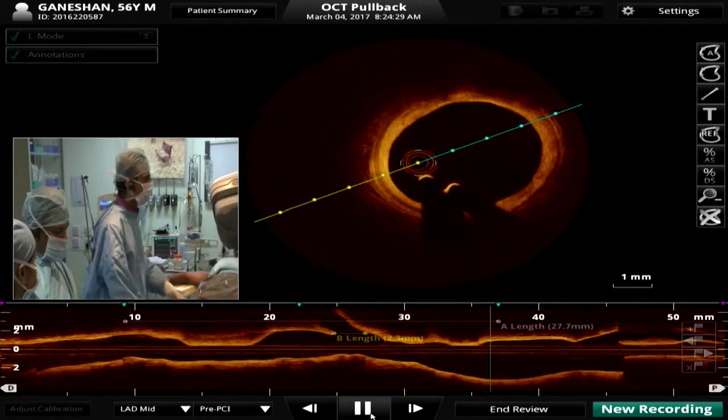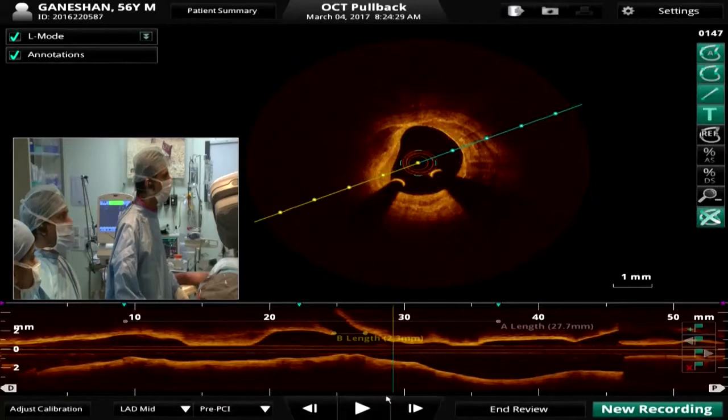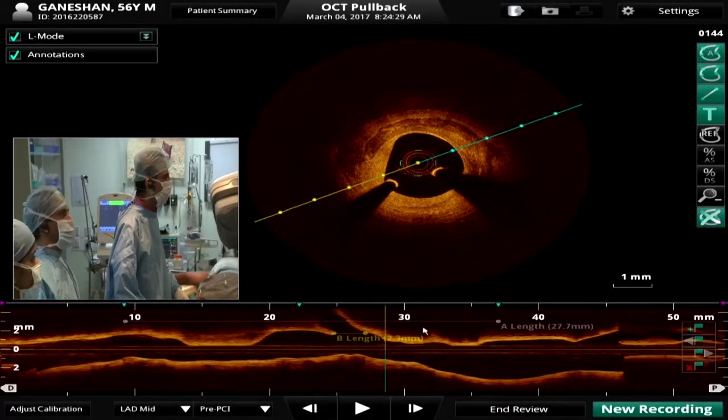Excellent, very revealing. Just one more question, if you allow, before you proceed. Would you consider two separate stents, given this large mismatch between the proximal size of around 4 and the distal around 2.5?